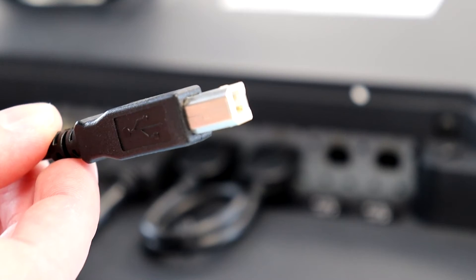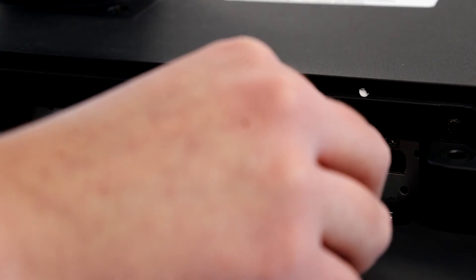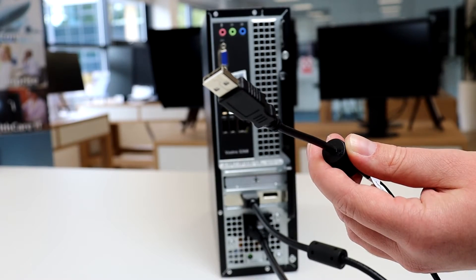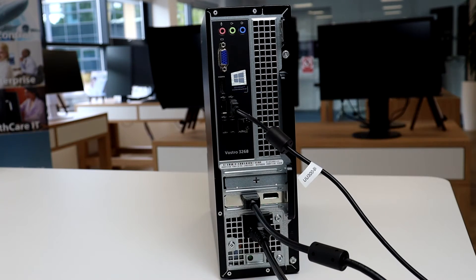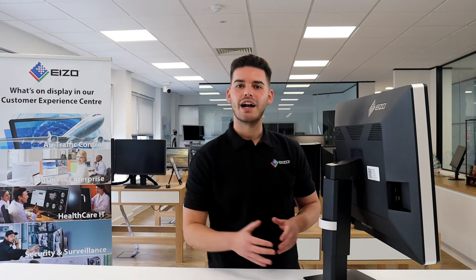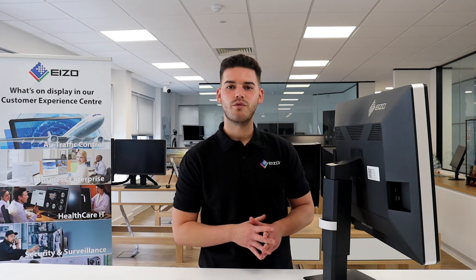Now connect the USB cable. The type B end gets plugged into the USB upstream 1 port and the type A end into your workstation. USB type A ports can also be found on the side of the unit and can be treated as a USB hub — for example, these could be used to connect your mouse and keyboard.